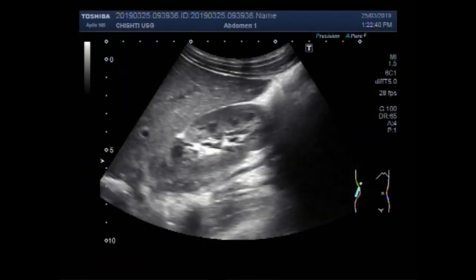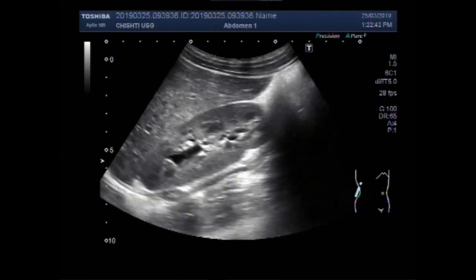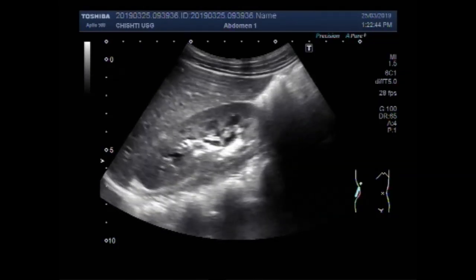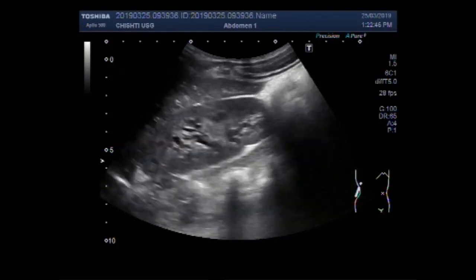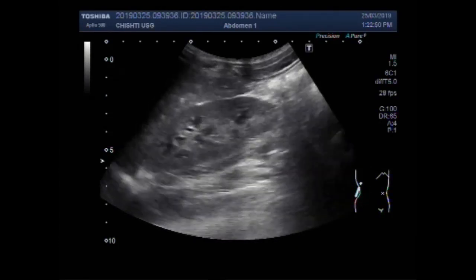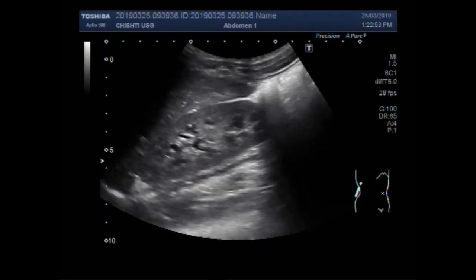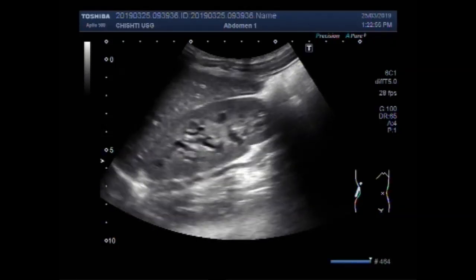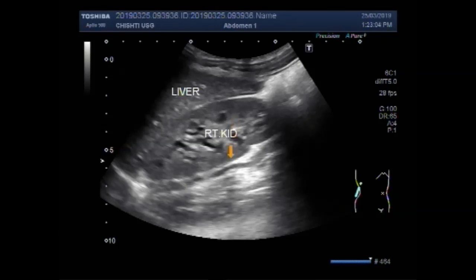Dear viewers, I hope you are all fine. This ultrasound video shows a stone in the ureter. You can see the kidney with the hydronephrosis. This is the right kidney and this is the liver. The age of the patient is seven years.